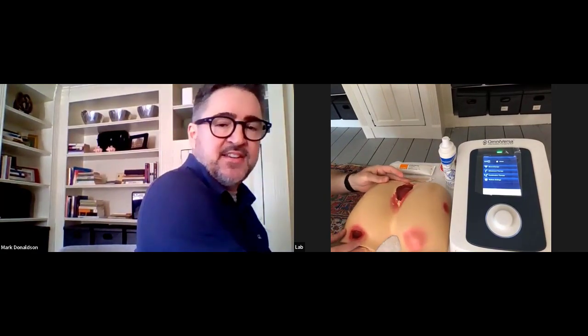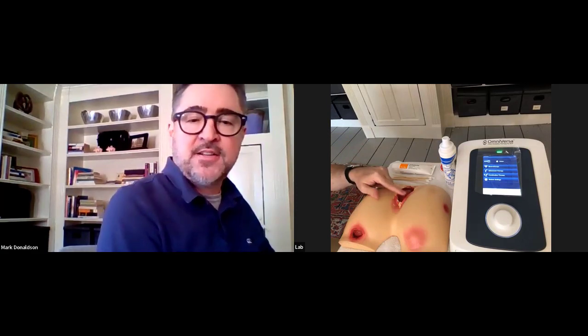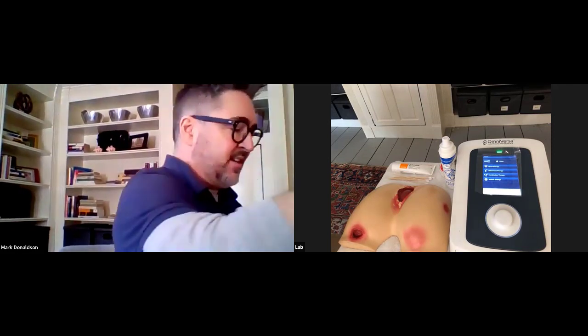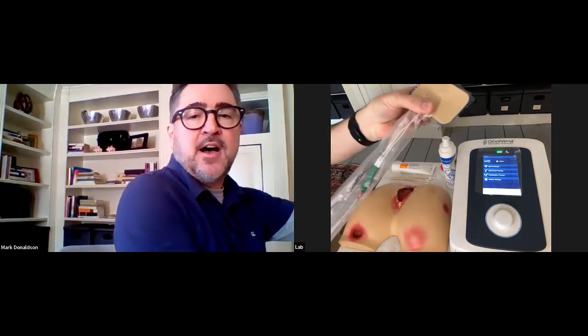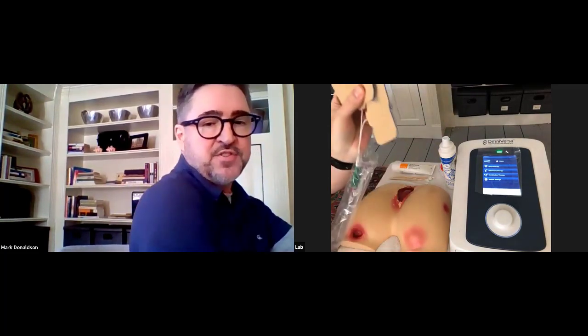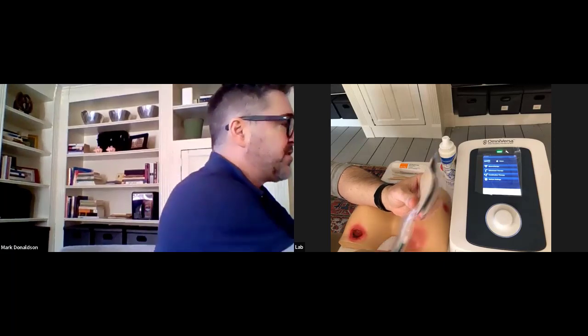Now we're going to do a couple of different setups. We've got our Omniversa here and our model. This unfortunate friend has a stage four sacral, a stage three ischial, a stage one ischial, and a stage two trochanteric wound. We're going to do setups for our stage four today. I've set up infection control ahead of time — covering the lead wires completely up to the unit. My contaminated hand is touching things that have a barrier, as the lead wires are multiple use, and we would always clean the lead wires afterwards.